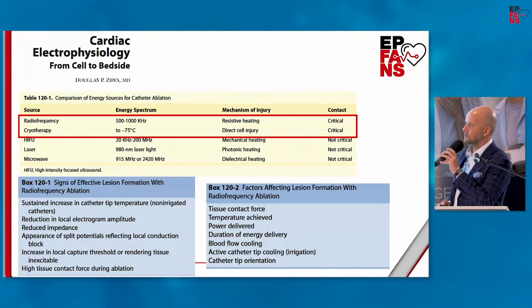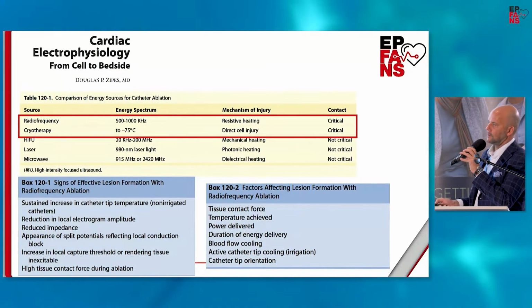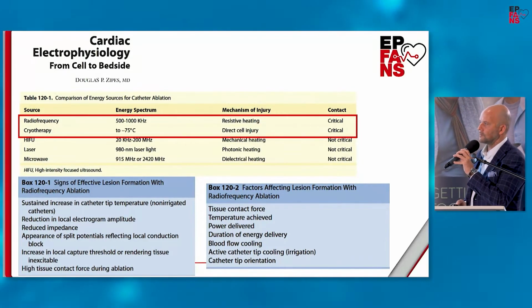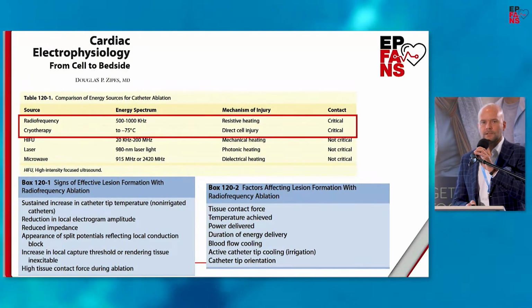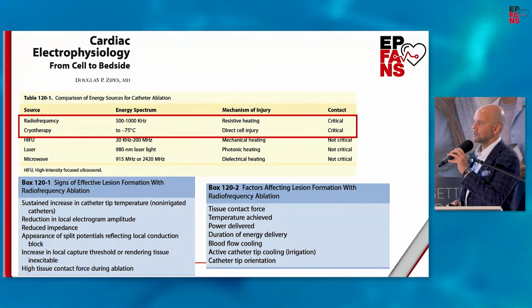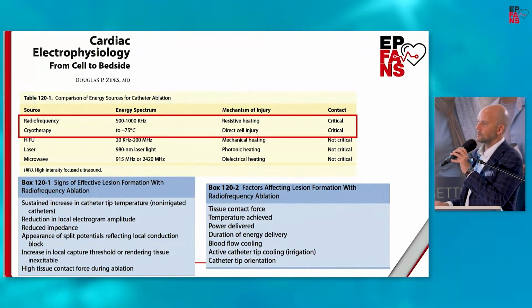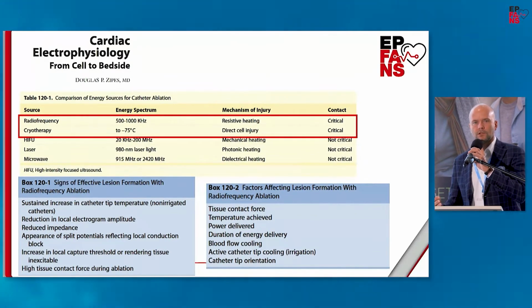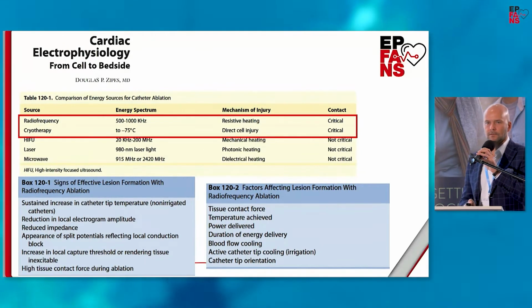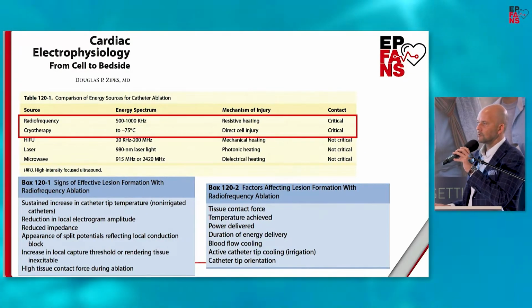In case of conventional RF ablation catheters, you must be aware of cavitary blood flow and its cooling effect in high flow regions like atrioventricular valve rings. This is important in case of accessory pathway ablation. In such a case, you will need more energy to achieve desired temperature. It's because the blood flow cools down the tip of the catheter.